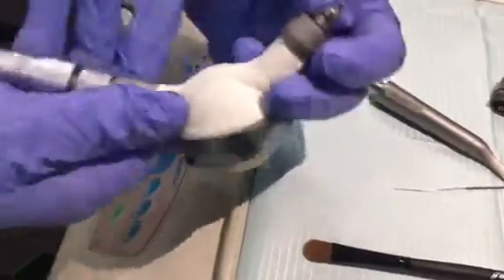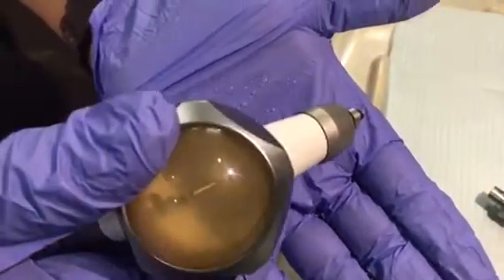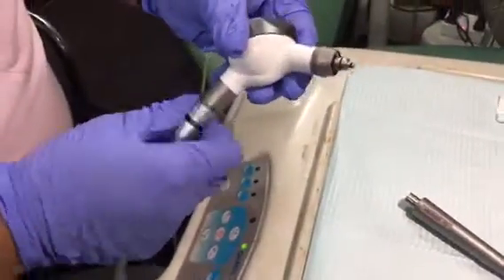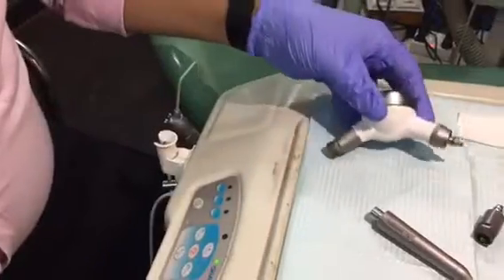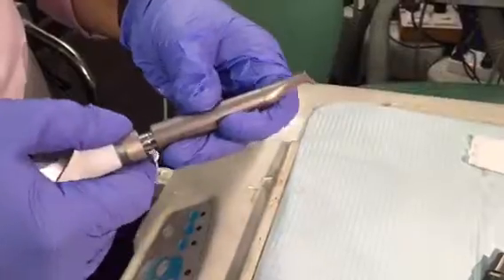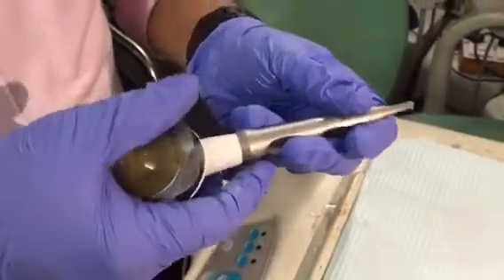little hole, so that way water will be getting out from this area. This is how you maintain your Esthetrix blaster every time after you use it. All these things are mandatory.